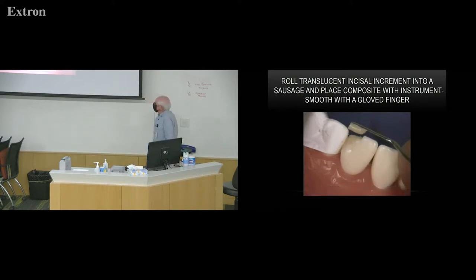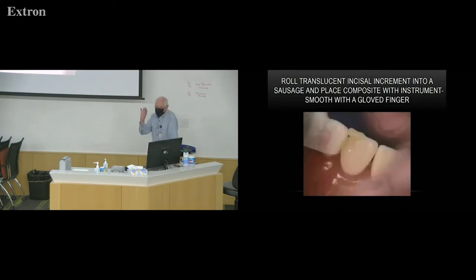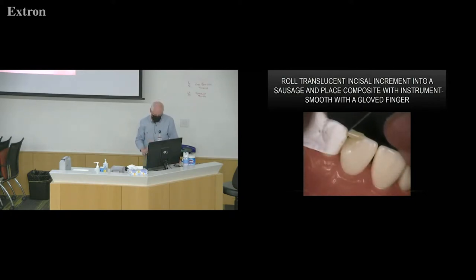And you'll notice 30 years ago, composite was a little stickier than it is now. Watch what happens when I slide that instrument over. With the composite we're using now, that doesn't happen. And I shouldn't be using my bare finger on this. It should be gloved. But use your finger. Tap it down and shape it. And then detail with your half hollenback.